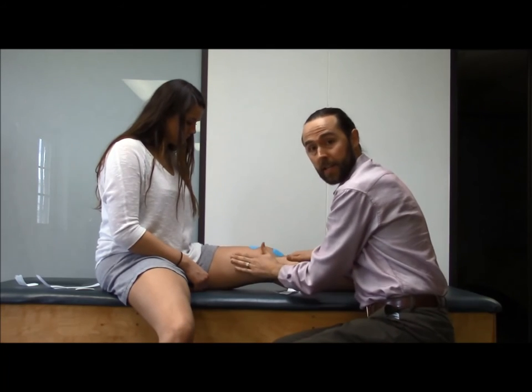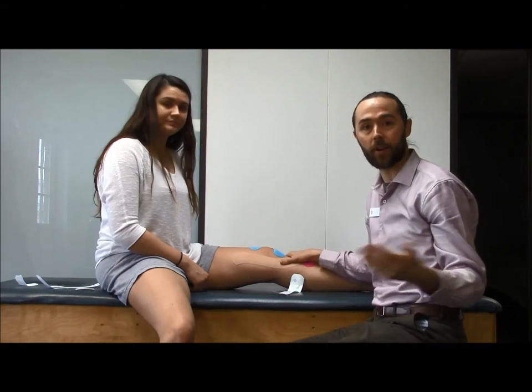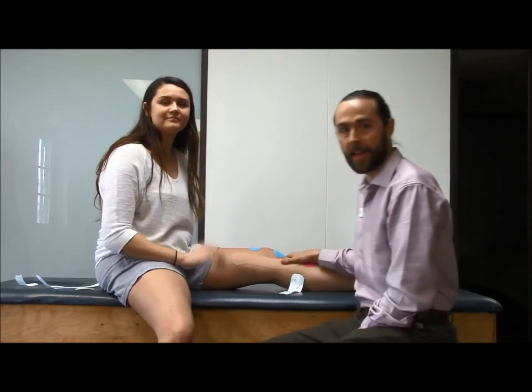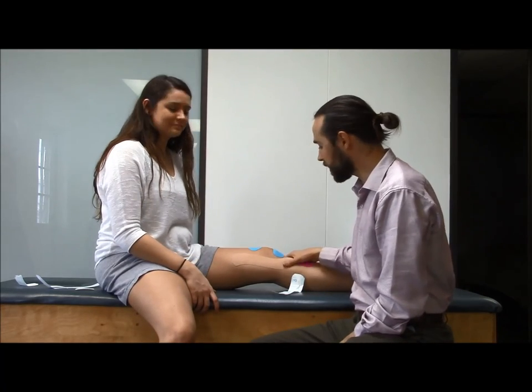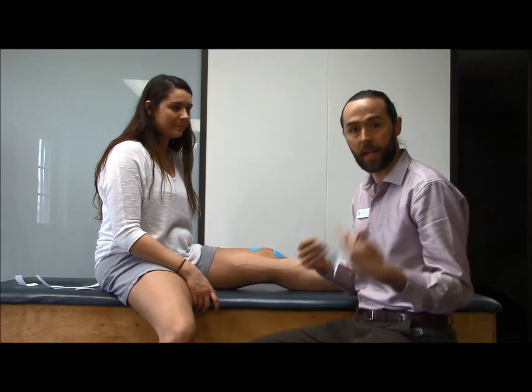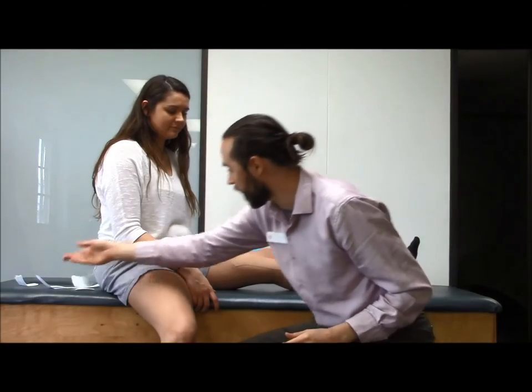Those are three fun techniques we can do for knee instability — whether you're out trying to walk on uneven ground, starting to hike, or doing something like running or jogging. You can use this to augment your stability. Or if you already wear a brace, you might like a little extra support, or if you're trying to get out of the brace, it provides a little less support than a brace would.